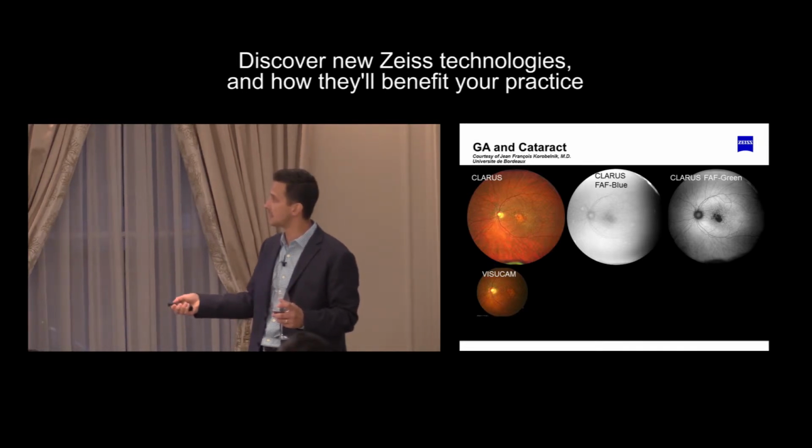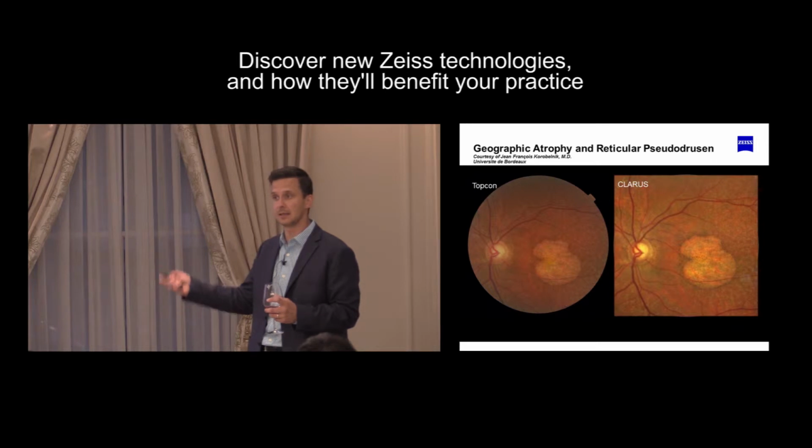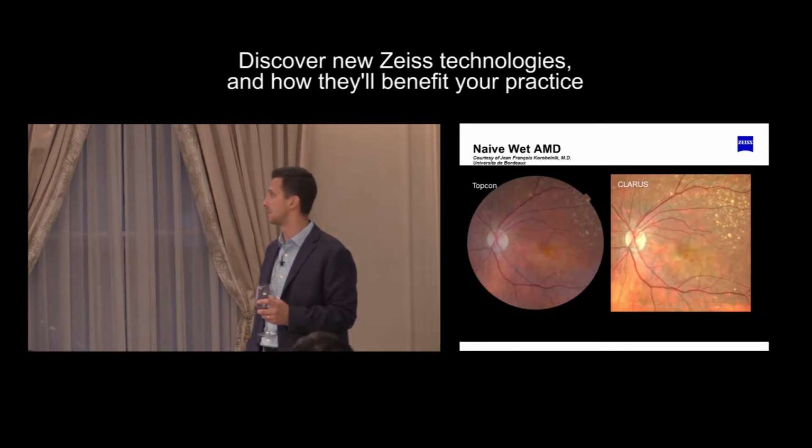And you can see the image in the Clarus against the VisuCam through that cataract. It's almost as if some of it's not quite as affected by the cataract in the same eye, in traditional imaging versus using the LED and the light source that's in here.